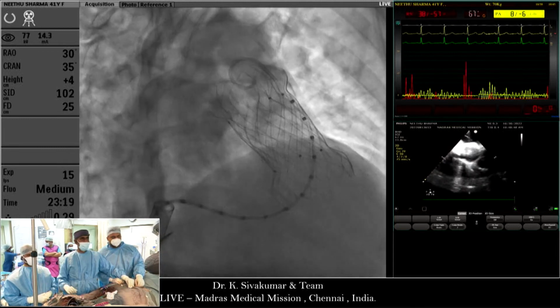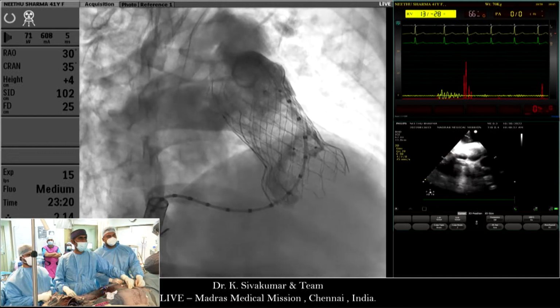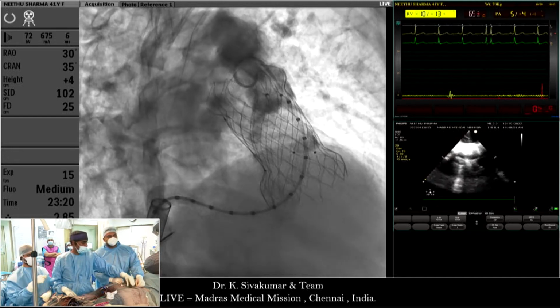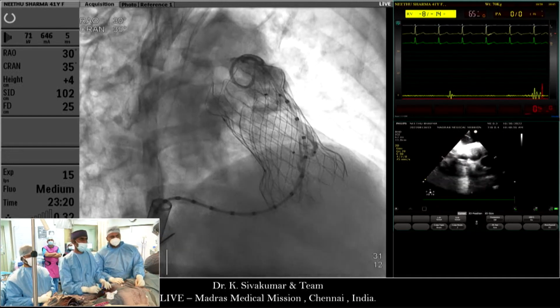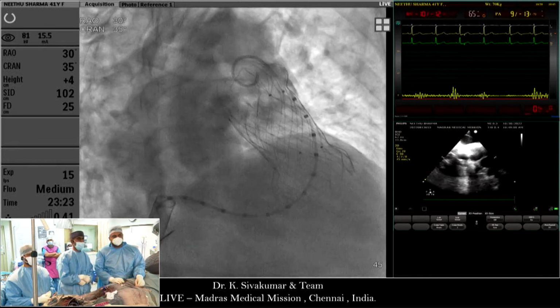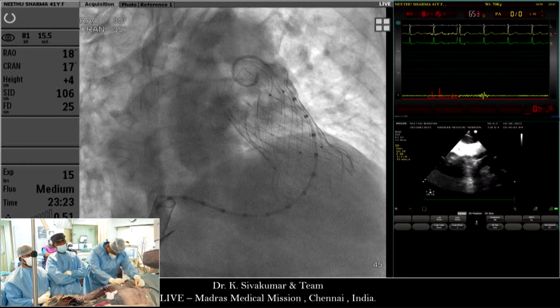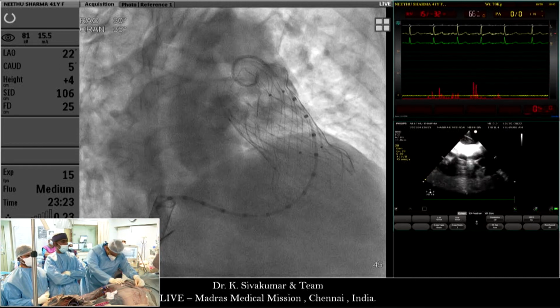Ready for angiogram? I think maybe a couple of holes are across. Show in lateral view. Can you move that? Shiva, if you could do the angiogram again, show this lateral view. Yeah, we are going to the lateral.